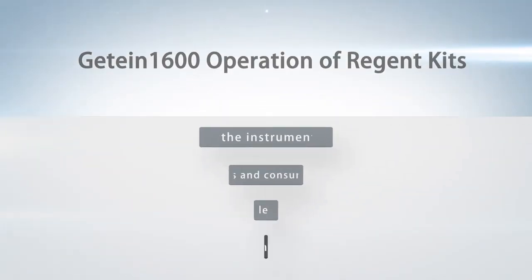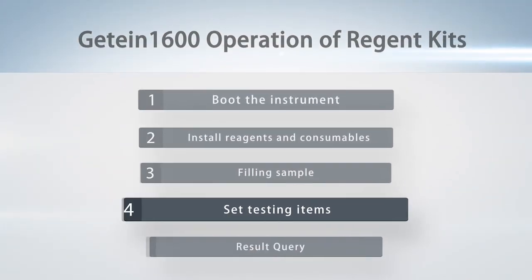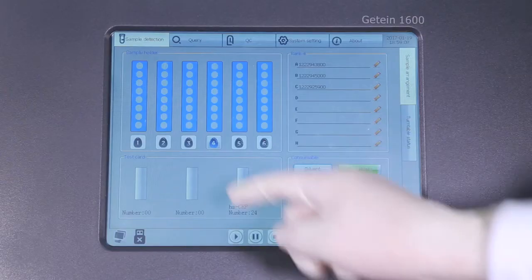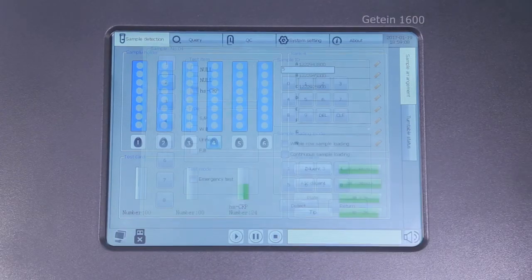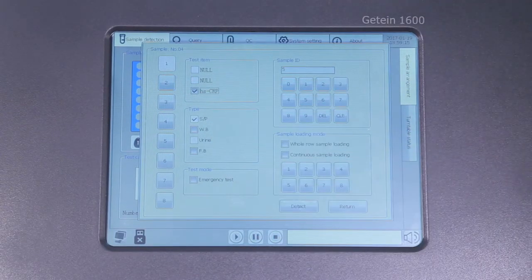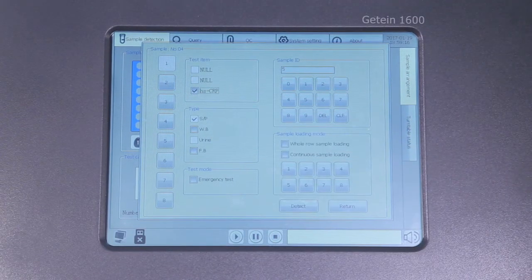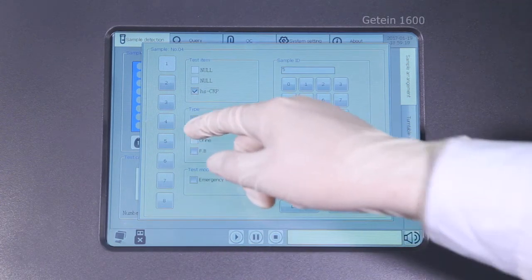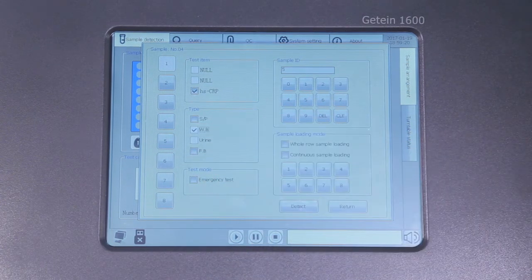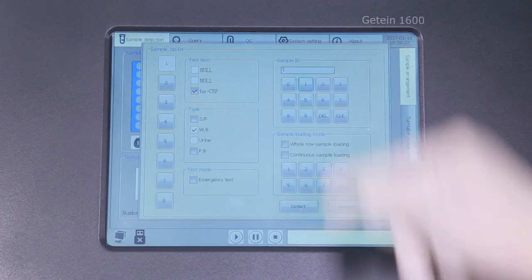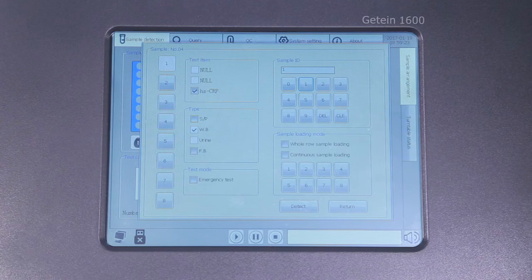Step 4: Set testing items. Test item: CRP. Sample type: Whole blood. Sample ID: Sample IDs are continuous numbers and only need to be set once.